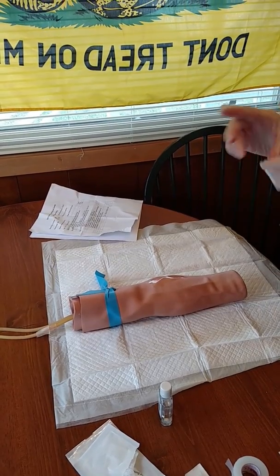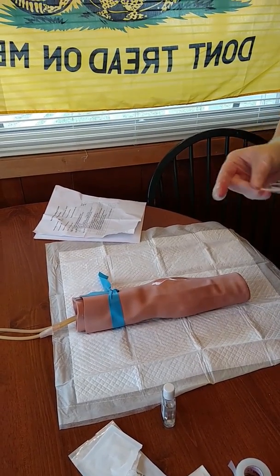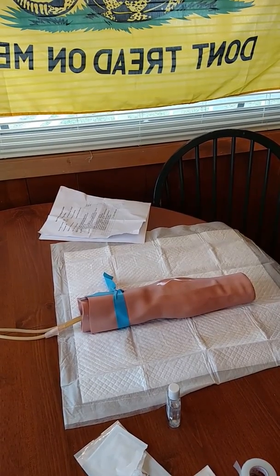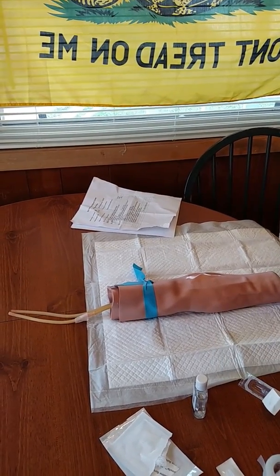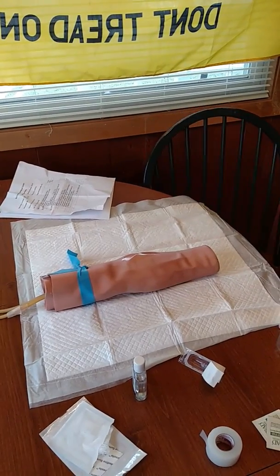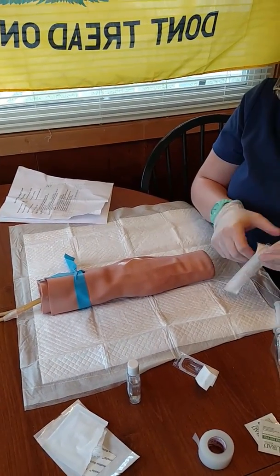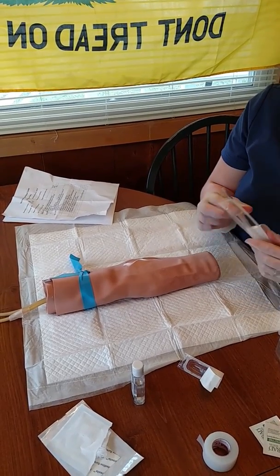Give that just a moment to dry and get this ready.